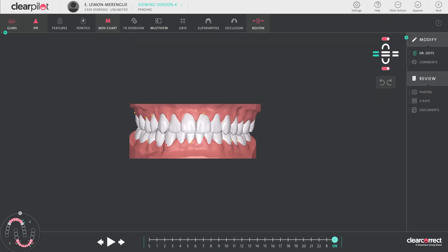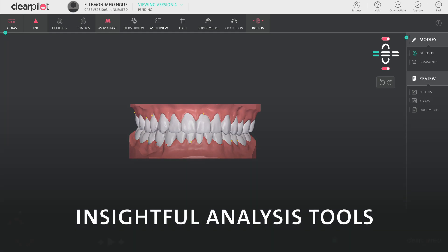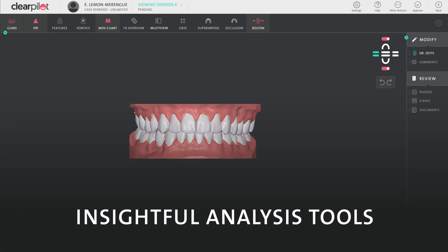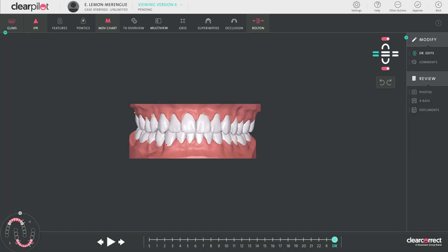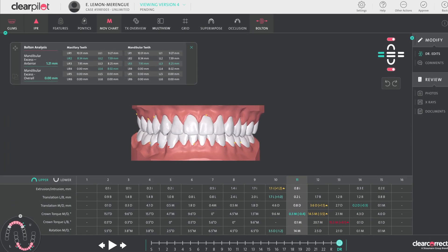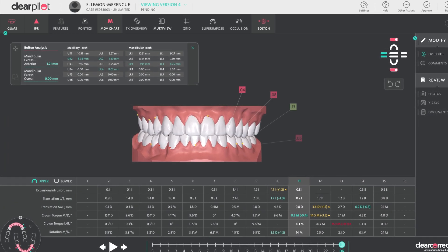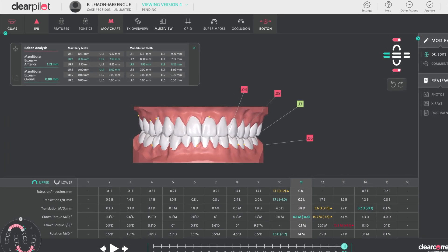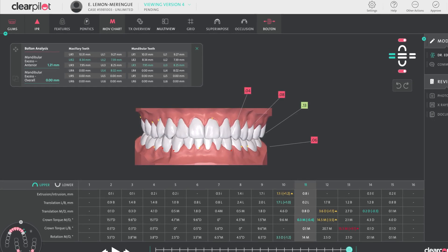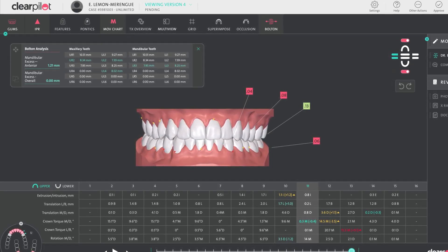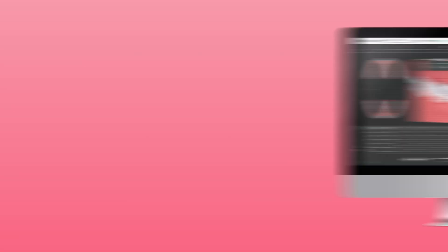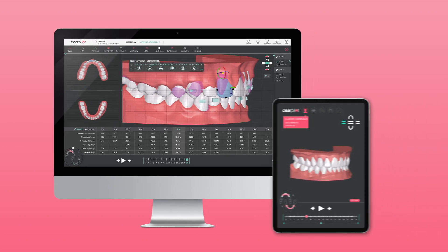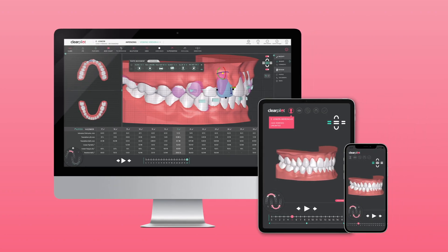For more detailed treatment planning, ClearPilot's insightful analysis tools can optimize your workflow even more. With Bolton tables, tooth movement charts, and collision monitoring, your treatment assessments can be more informed and more precise than ever before.